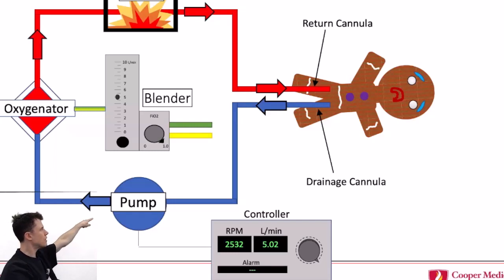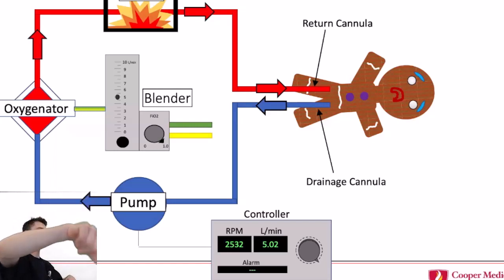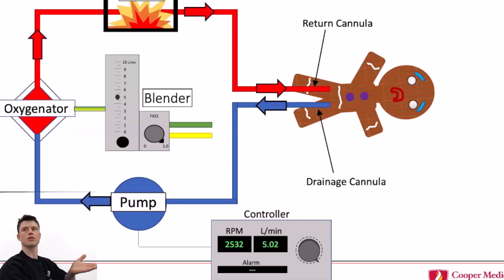Coming out of the oxygenator, I depicted the warmer as a separate component, but you'll see when we go up to the circuit, and you've probably seen it at the bedside, it's not really separate in that setting. It's just easy to see this way. It's usually hooked into the oxygenator, where there's warmed water circulating and keeping everything warm. Think about our patients on CRRT, right? We often have to put them on a Bair Hugger because they get cold from the exposure of the circuit, even more so with ECMO. So this helps us to control their temperature.